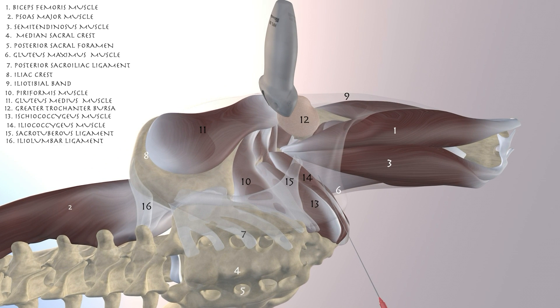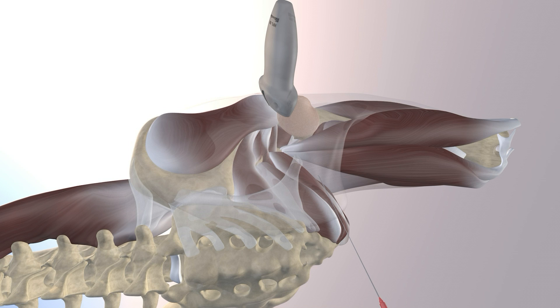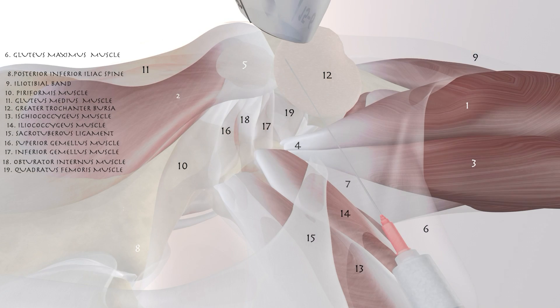This is an in-plane approach with the probe in an axial plane over the proximal lateral thigh. We're essentially going right into that trochanteric bursa, which lies underneath the iliotibial band and over the gluteus medius tendon. You can also appreciate some of the deep external rotators of the hip.